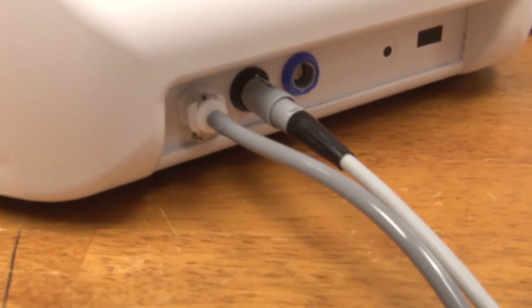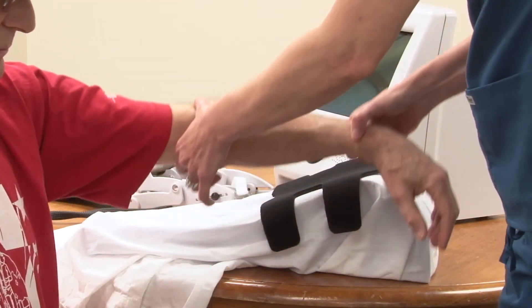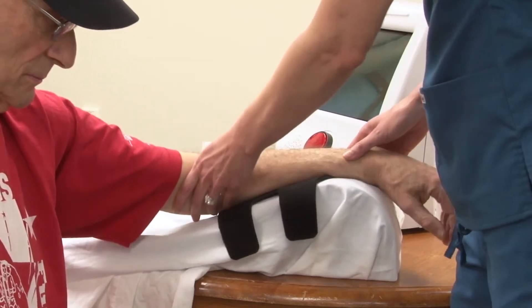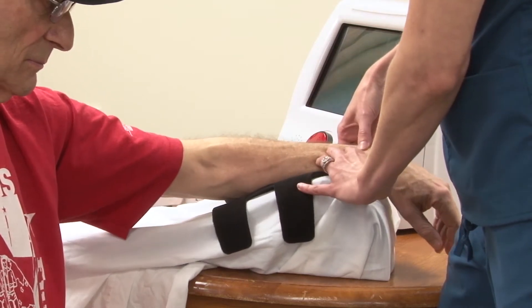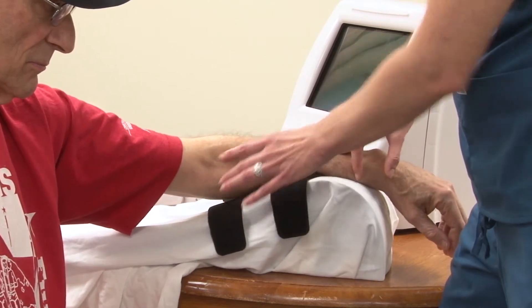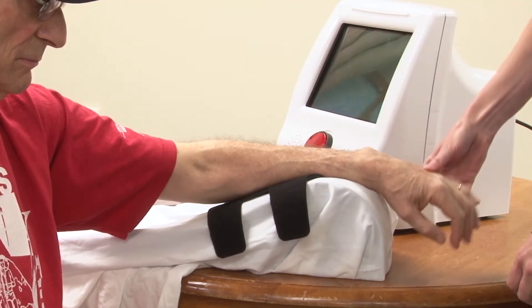Now the device is plugged in and ready to go. Let's talk about positioning in order to use the Hand Mentor. When working with the Hand Mentor, it's important to ensure that there is free range of motion about the hand. To ensure this on the supporting surface, allow two to three inches of extra room around the wrist joint. This allows free flexion and extension around the hand.